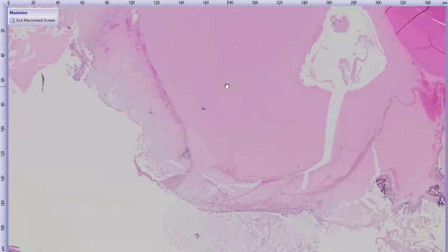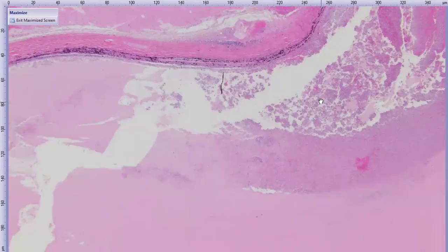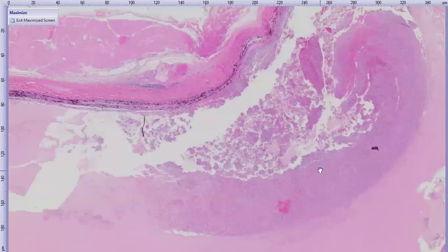All of this pink stuff here is basically just high protein fluid in the vitreal chamber, along with the hemorrhage, which is bright red. And then there are cells, which are the purple, and we'll look closer at those cells. But we've got more of the endophthalmitis kind of closer to the optic nerve head here with these purple areas. We can see from even lower magnification, the cupping and atrophy of the optic nerves. This globe did have glaucoma and some more clumps of this inflammatory exudate in kind of the posterior vitreous and or subretinal space, and kind of carpeting the epichoroidal surface in some areas. So let's see, we're going to drop in right here in the midst of the vitreous.